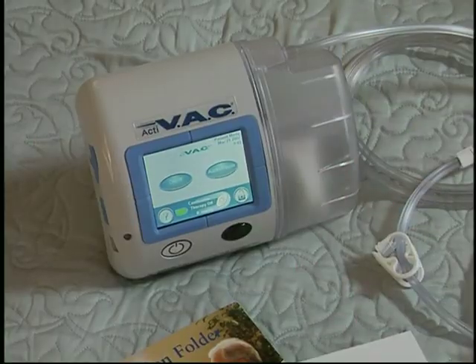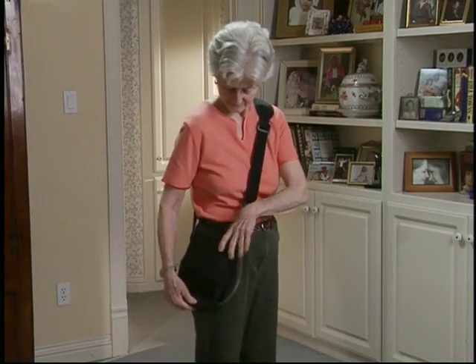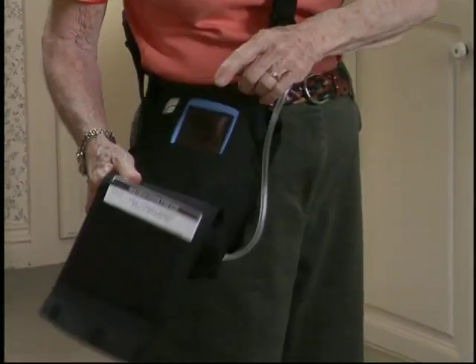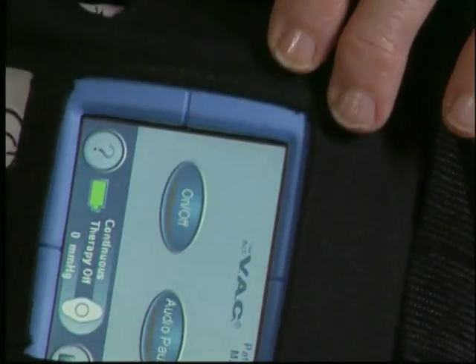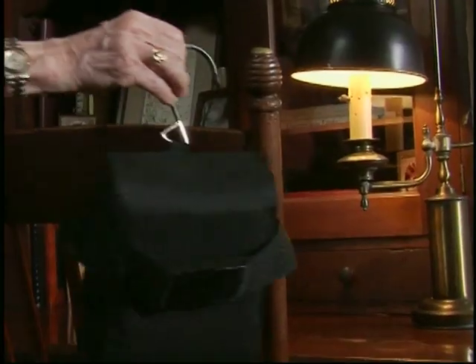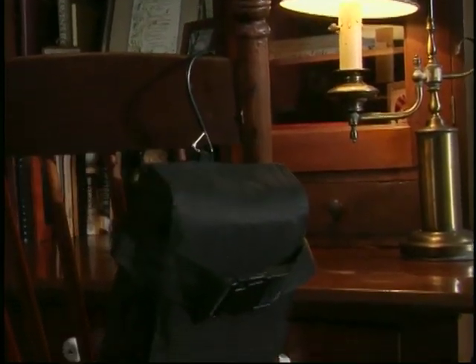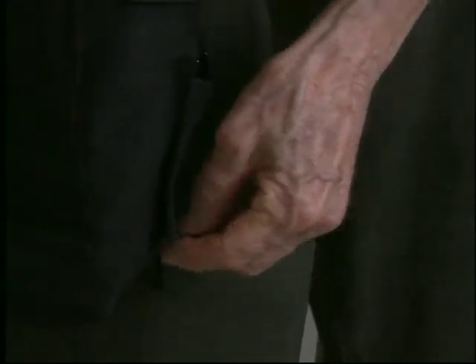The ACTIVAC Therapy unit is sleek and very light — just over two pounds — so it can easily go wherever you do. The touch screen is simple to use and easy to read. The carrying case lets you wear it on your belt, over your shoulder, or you can hang it from a chair. A compartment lets you discreetly store excess tubing out of sight.